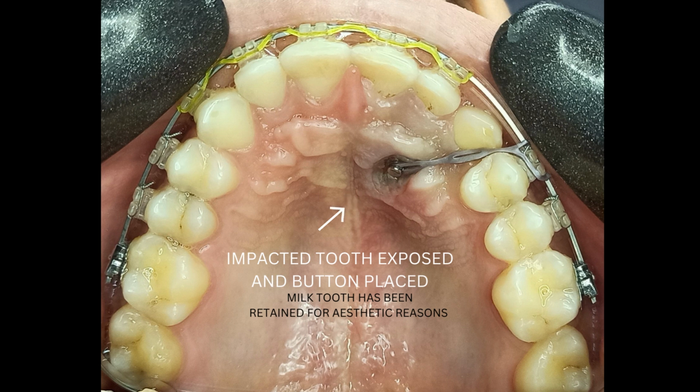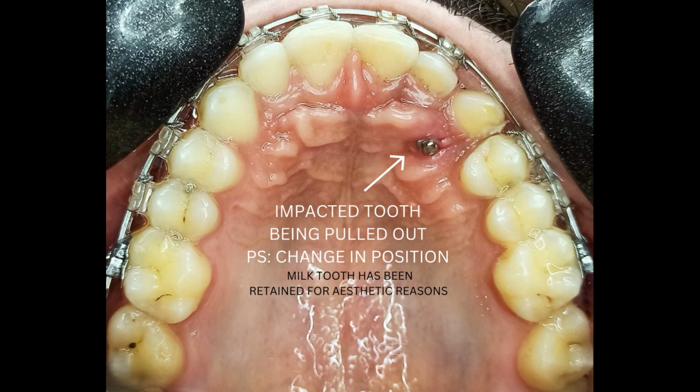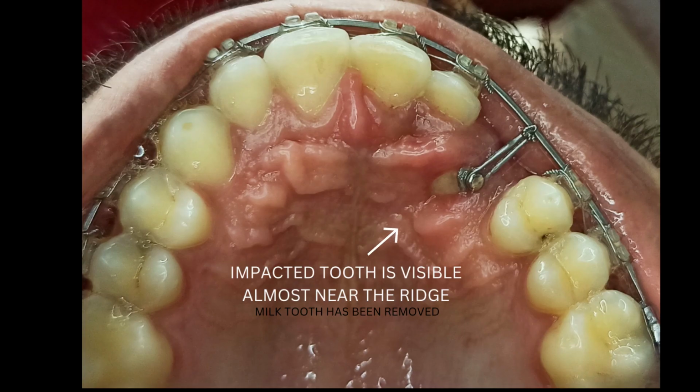After the patient's consent, we went ahead with the second treatment plan. The impacted tooth was surgically exposed and a button was placed on it. We retained the milk tooth for aesthetic reasons. As the forces were being applied, we can see that the tooth is moving away from the midline towards the ridge. Downward and outward forces are being applied, and here we can see that the tooth had been exposed. The deciduous tooth got dislodged, so we removed it.